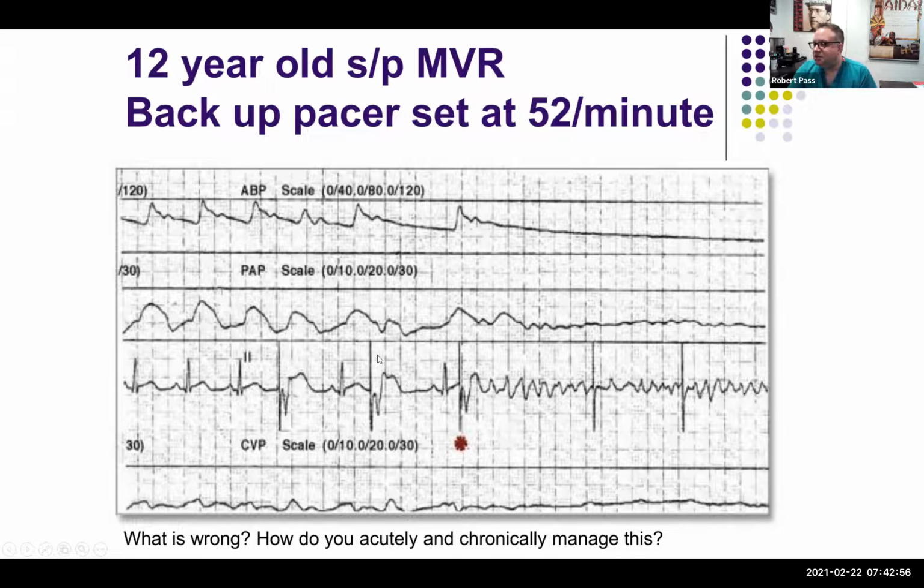Similarly, this is also at a rate of like 150 from the last QRS, and yet it's pacing. And then what happens here? We have appropriate beats, and then again it paces, but then it paces on the T wave, and so we've tipped the patient into some ventricular arrhythmia. This looks like VFib to me. Yes, so it seems like we've tipped the patient into VFib.